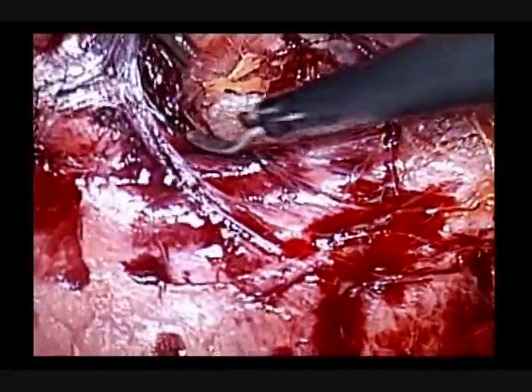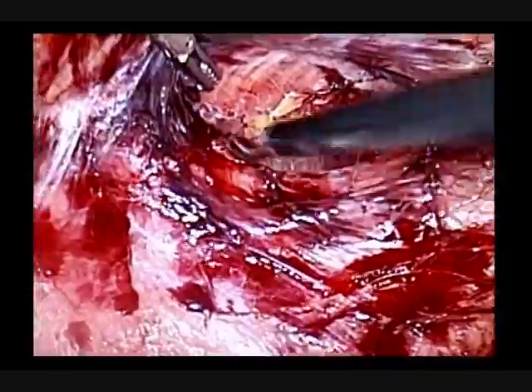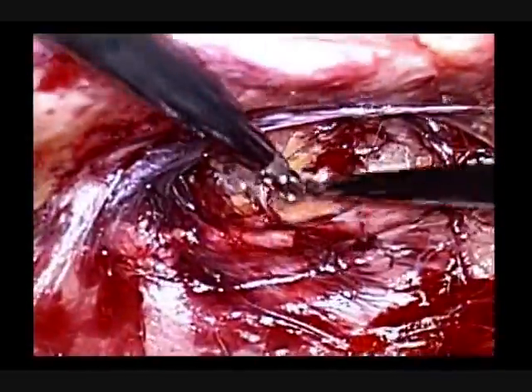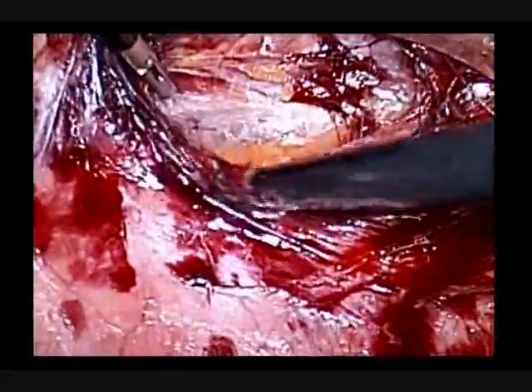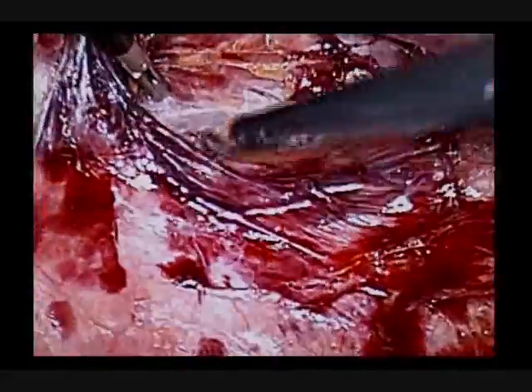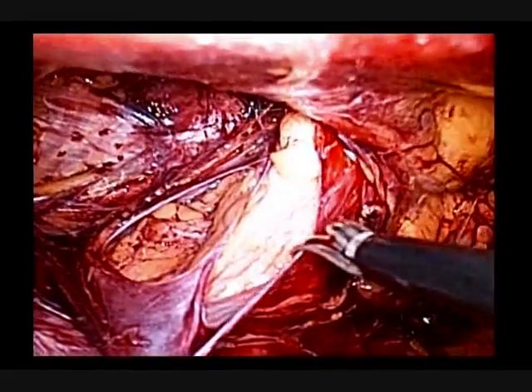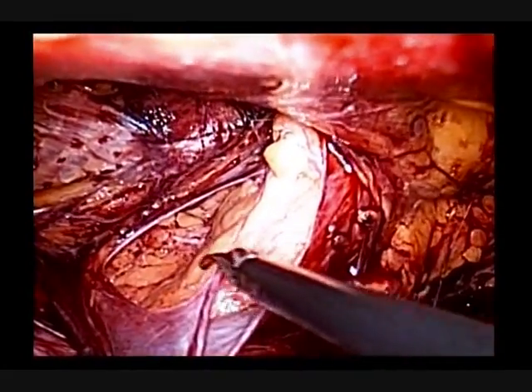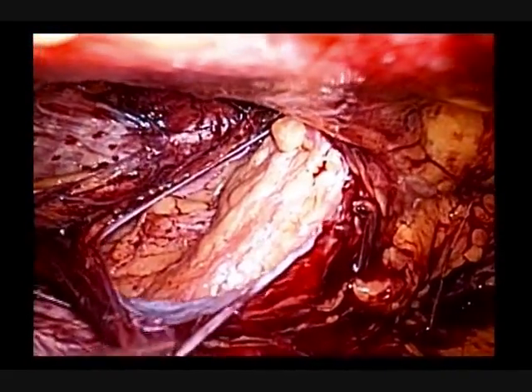Extra-peritoneal view of a large incarcerated left inguinal hernia. Bogro's space is dissected. Since reduction of the hernia content is not possible, careful division of the hernia sac is therefore performed.